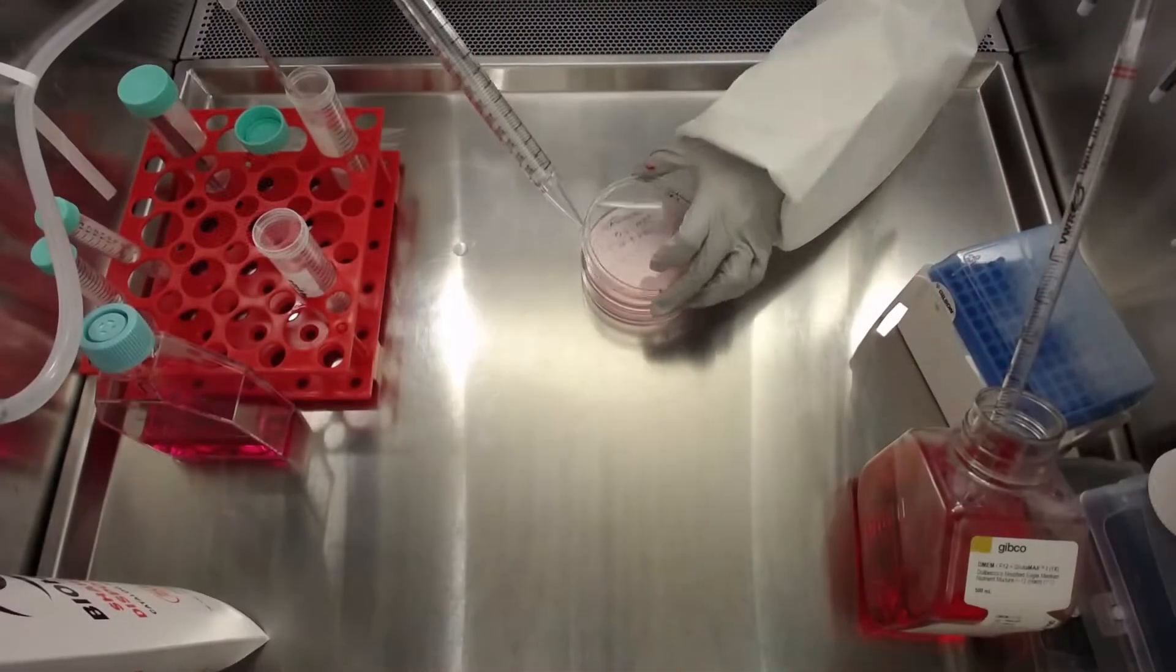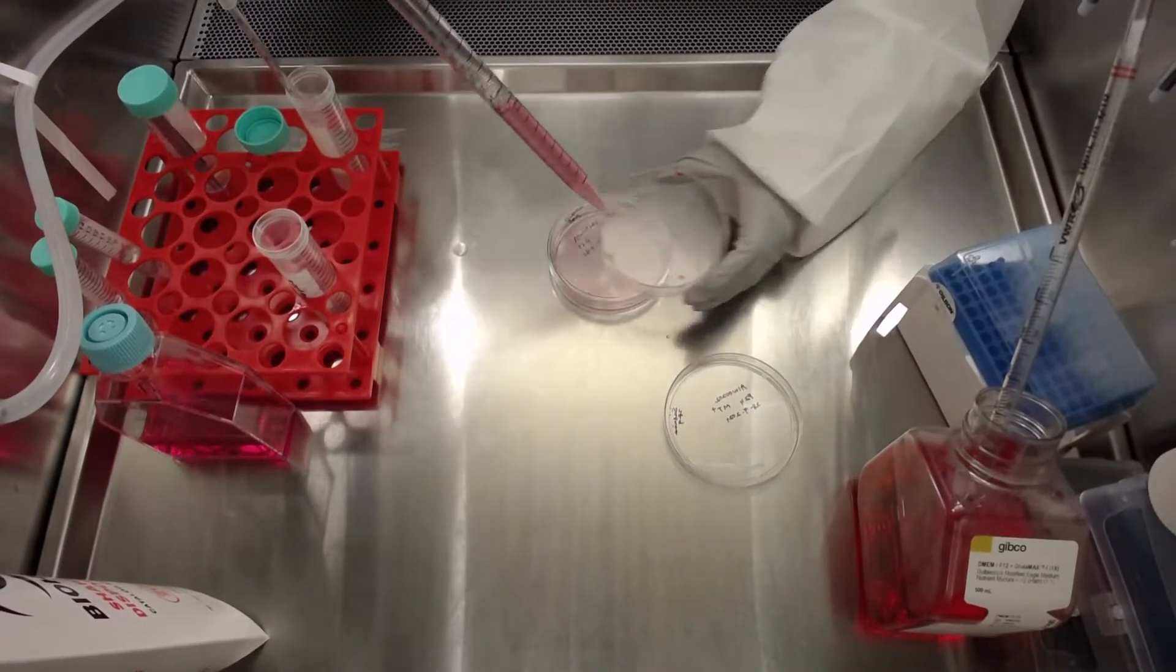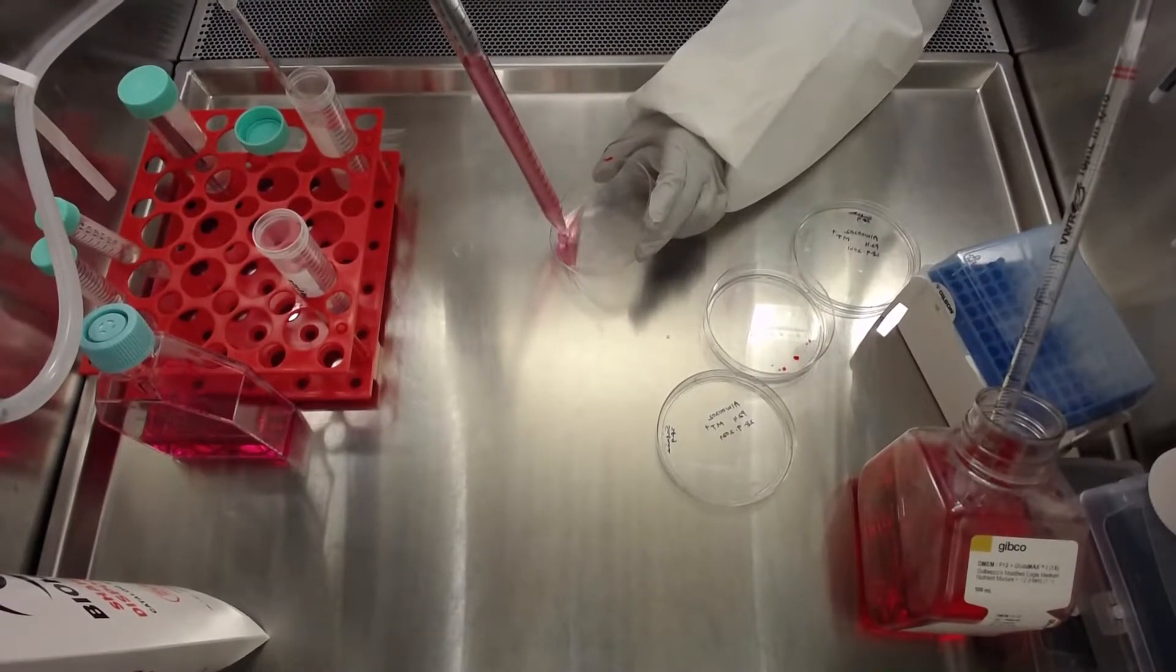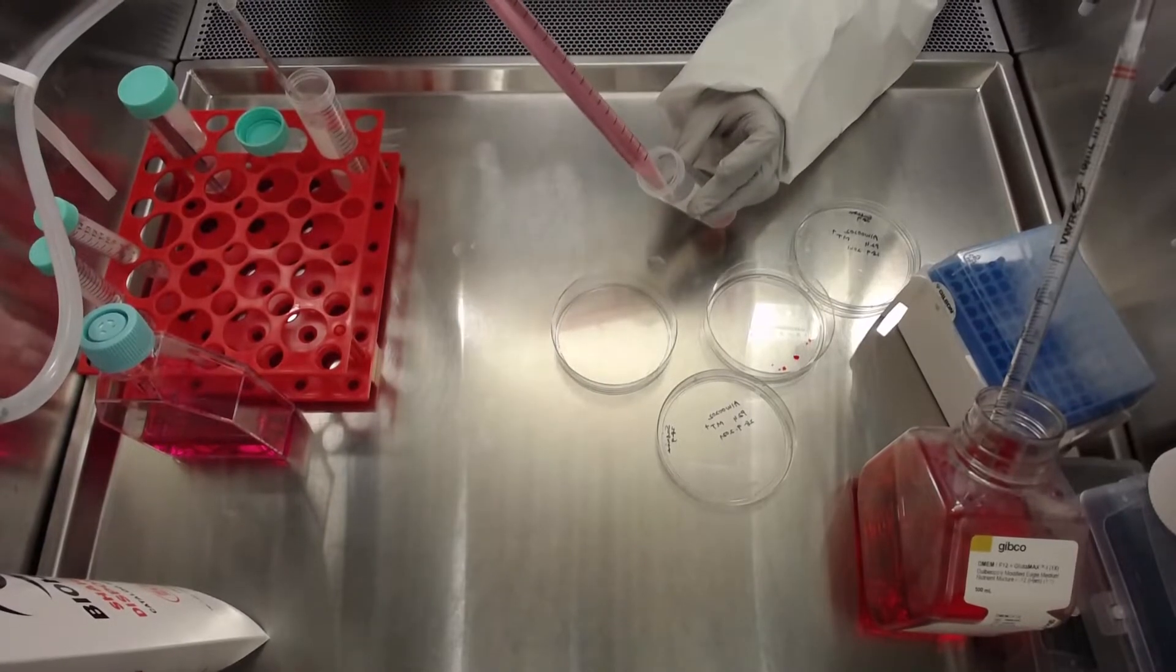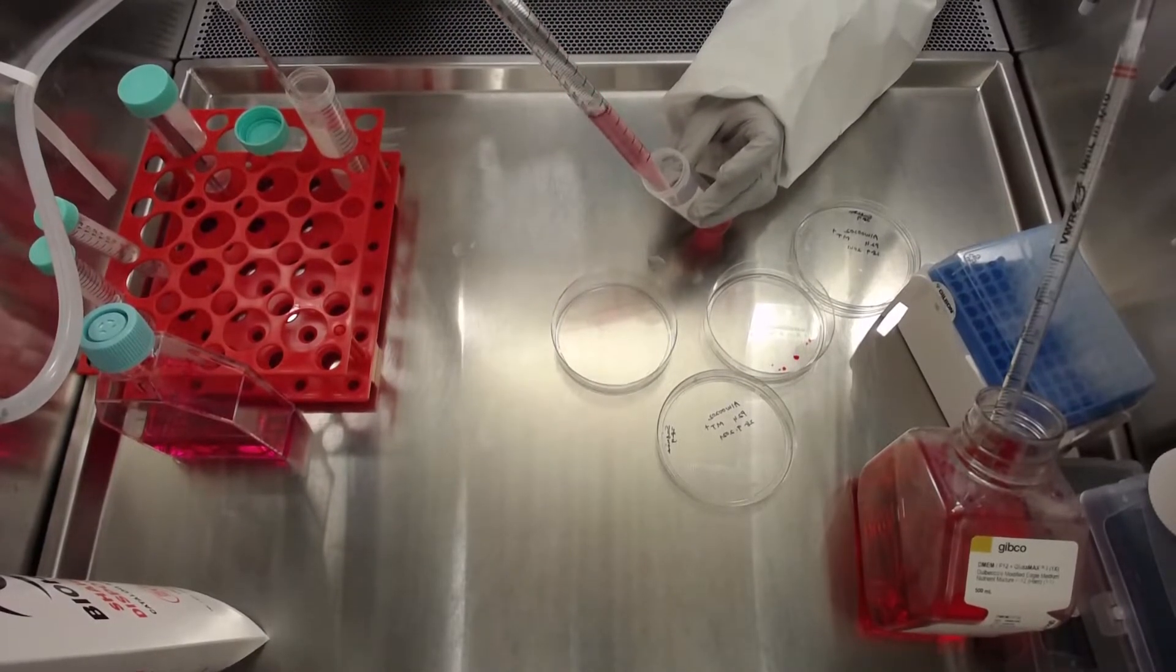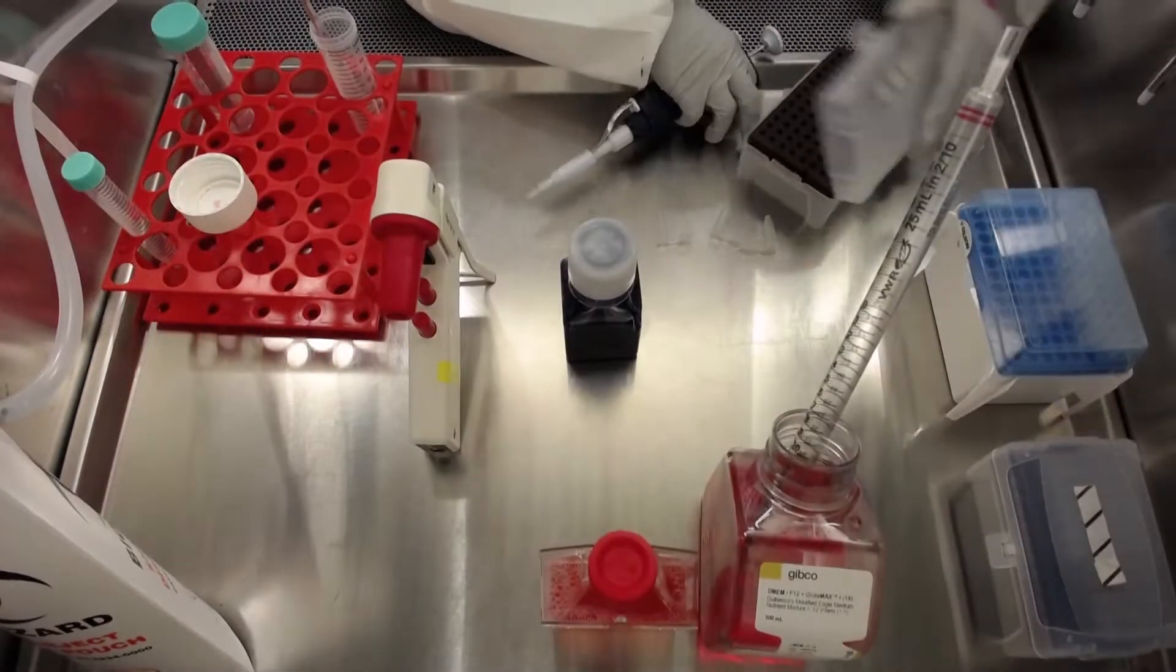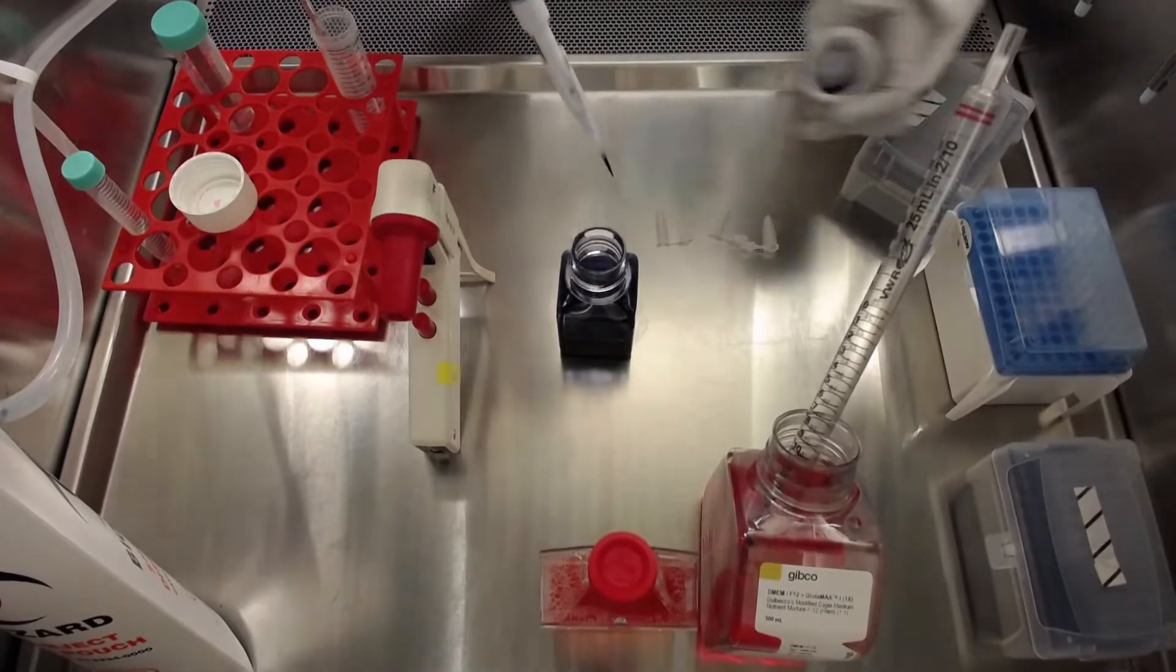Transfer all the volume of the cell suspension from both dishes into a 50 milliliter tube. In order to collect as many cells as possible, wash the dish with an extra 5 milliliters of DMEM F12, and then transfer all the volume to the same 50 milliliter tube. It is important, however, to minimize pipetting of the cells at this step to preserve their viability.